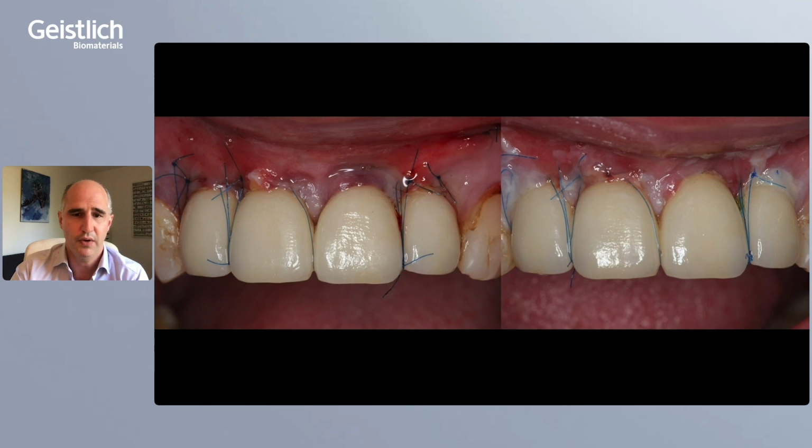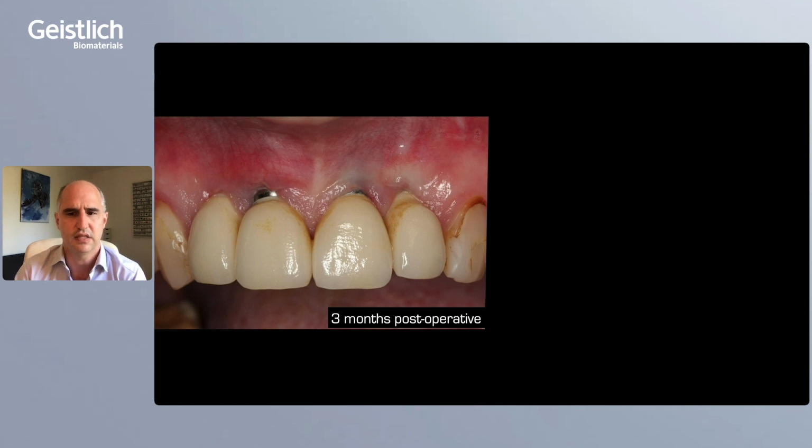And I pretty much did the same thing that I would have done around teeth. So I thickened the periodontal biotype, I stabilized the flap in a more coronal position, and I used keratinized tissue in order to overcome this problem in this situation. Well, this is the clinical situation directly post-operative, and this is the situation 10 days after surgery. And you clearly see, the result is not bad for 10 days after surgery. And most of you are experienced with recession coverage around teeth. You all know if you have achieved this result after 10 days, you probably are sure that this is going to be a good result. However, not around implants. This is 3 months post, and this is 6 months post.